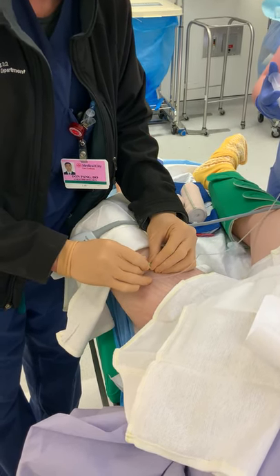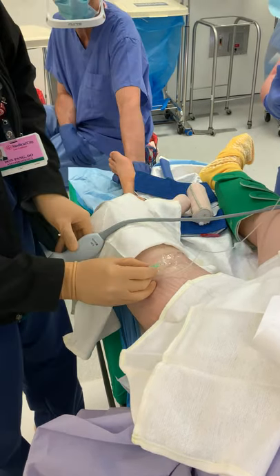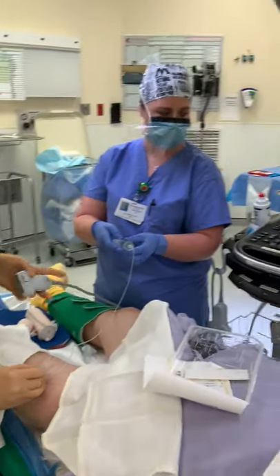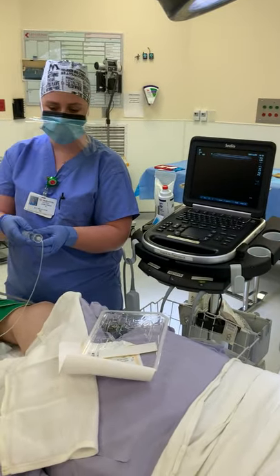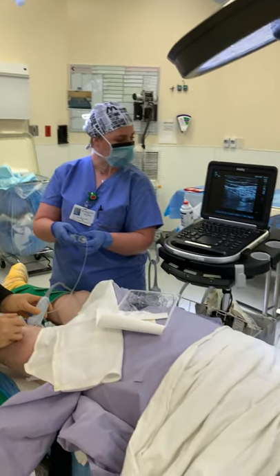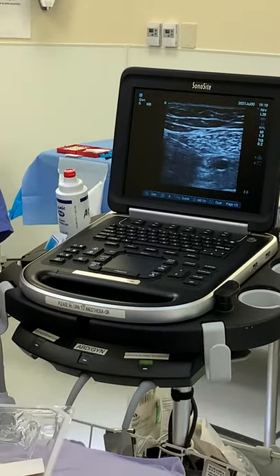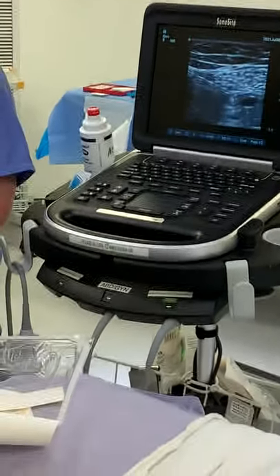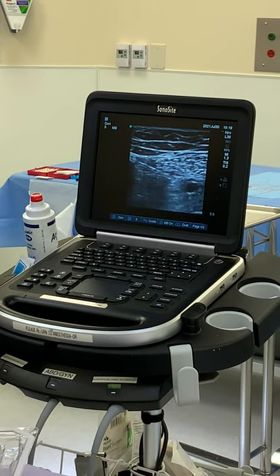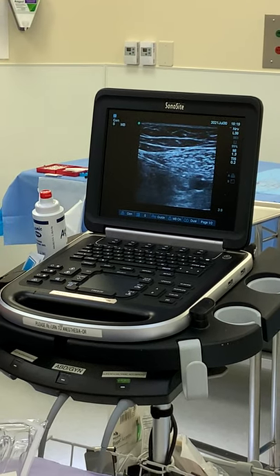Connect it. Make sure that it is secure. Then we're going to prove to ourselves that it is still in the right place by going back to the ultrasound. As you can see, the catheter is traveling into the space now. Amanda, would you just give me an aspiration here? Give me a few more cc's here. As you can see, there's a little bit of air that went through, but it has appeared to be still in the right place.